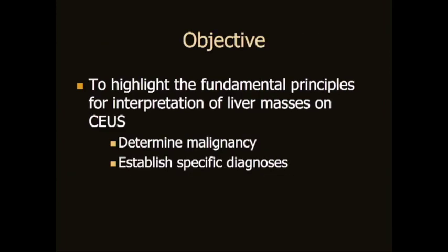So the objective of this talk is going to be to highlight the fundamental principles for interpretation of liver masses on CEUS. And we're trying to, first of all, determine which masses are malignant, and then to establish their specific diagnoses. So this presentation is very basic, but I selected it because of the timing at the SRU, when microbubbles have been approved for just over a year.